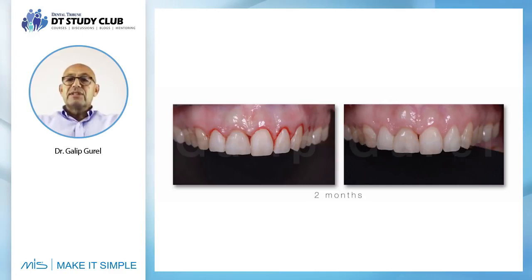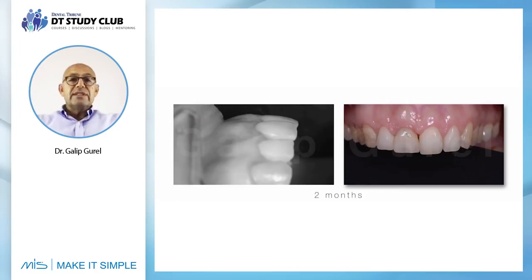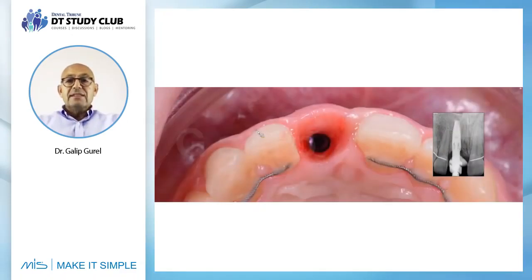The provisional tooth is in the mouth, but this time it is loaded on the implant, and in this zone we are forming a very nice subgingival contour of the socket. And we see how much soft tissue we have in this zone just because we augmented it properly with bone and soft tissues. And this is the final healthy shape of this socket.